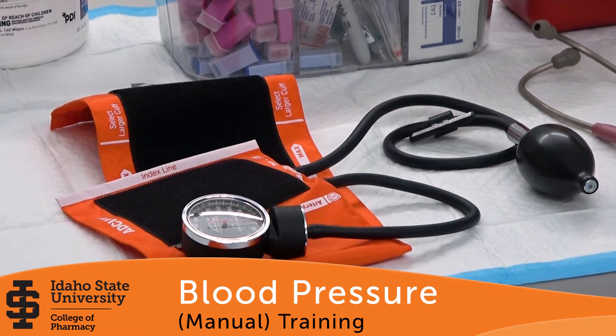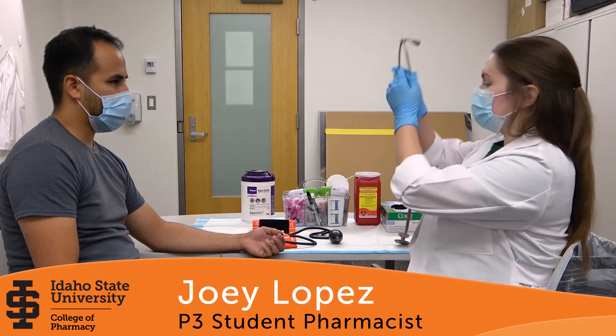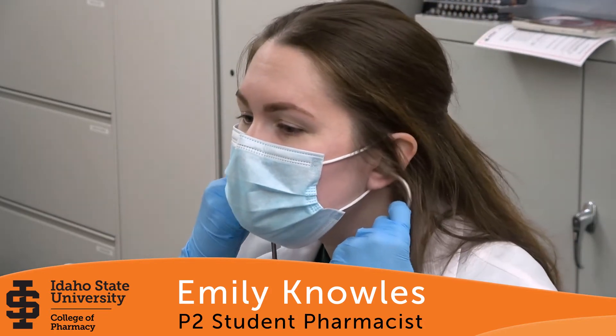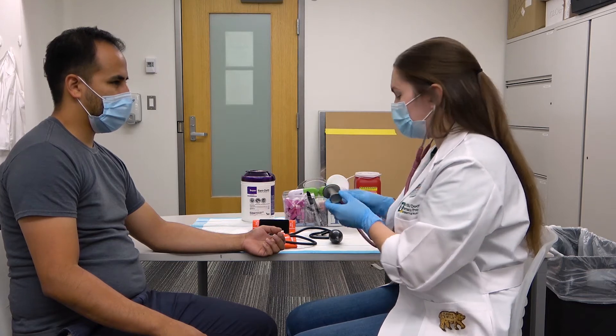Hello, welcome to the manual blood pressure check training video. To begin, using the stethoscope, ensure the earplugs are facing out. Insert the earplugs into your ears. Check for response by tapping on the diaphragm.